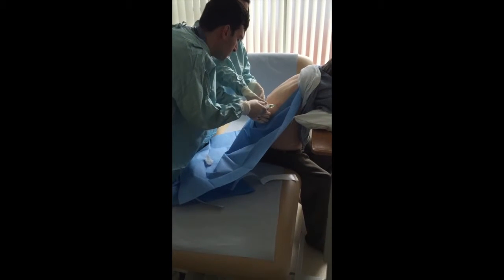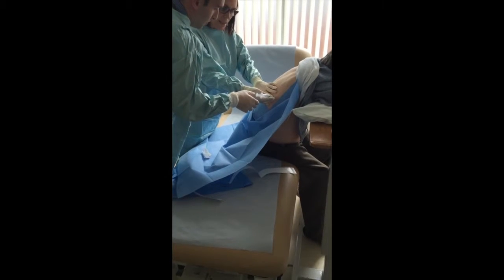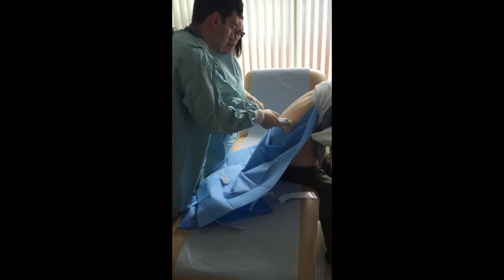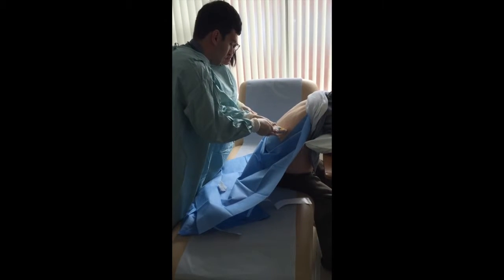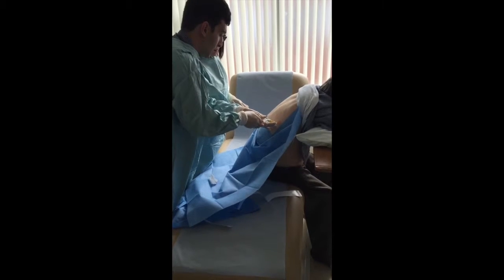So once you get pleural fluid at that position, what you're going to do is insert a tiny little bit more, just so that you get through into the parietal pleura. And then just take a good aspirate now. And always make sure that you can see that it's coming away nicely. Okay, that's fine. So remember the depth and the angle that we've gone in with that. And what you're going to do is you just come out now.